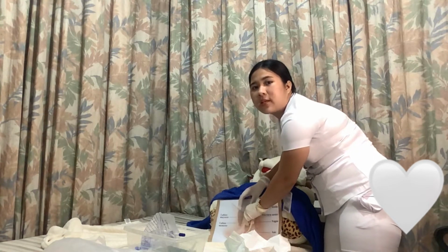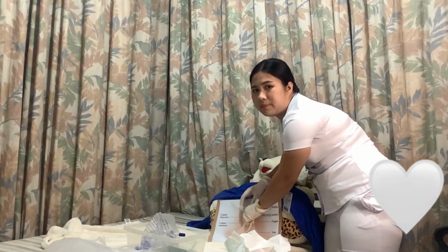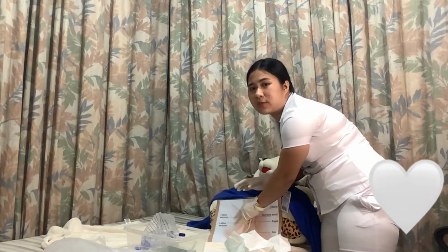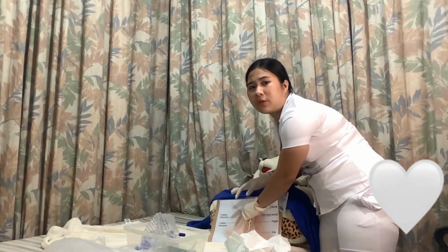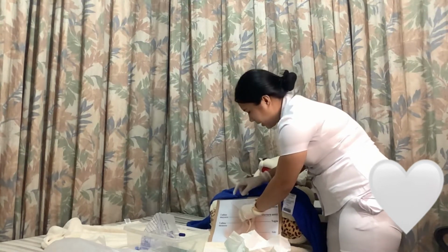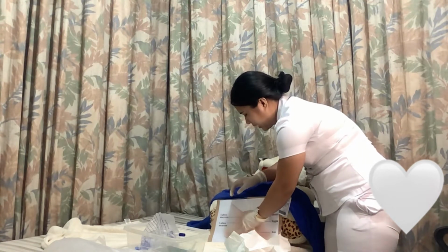So, separating the area surrounding the meatus provides visibility. So, insert the catheter into the meatus for 2 to 3 inches or until urine begins to flow. So, the female urethra is approximately 1.5 to 2.5 inches. So here, I'm gonna insert it 2 to 3 inches.